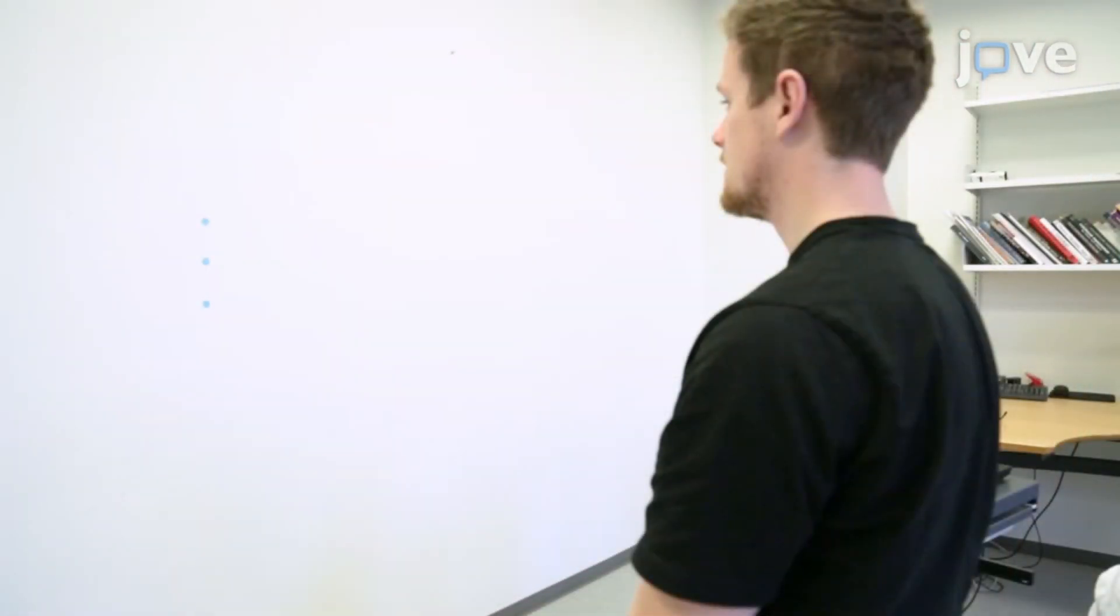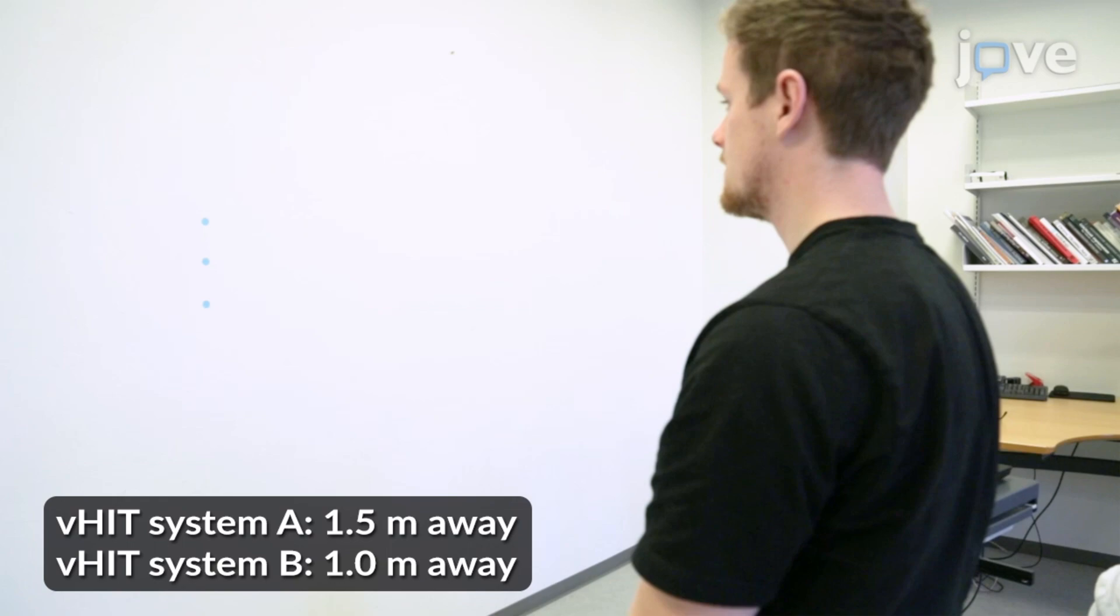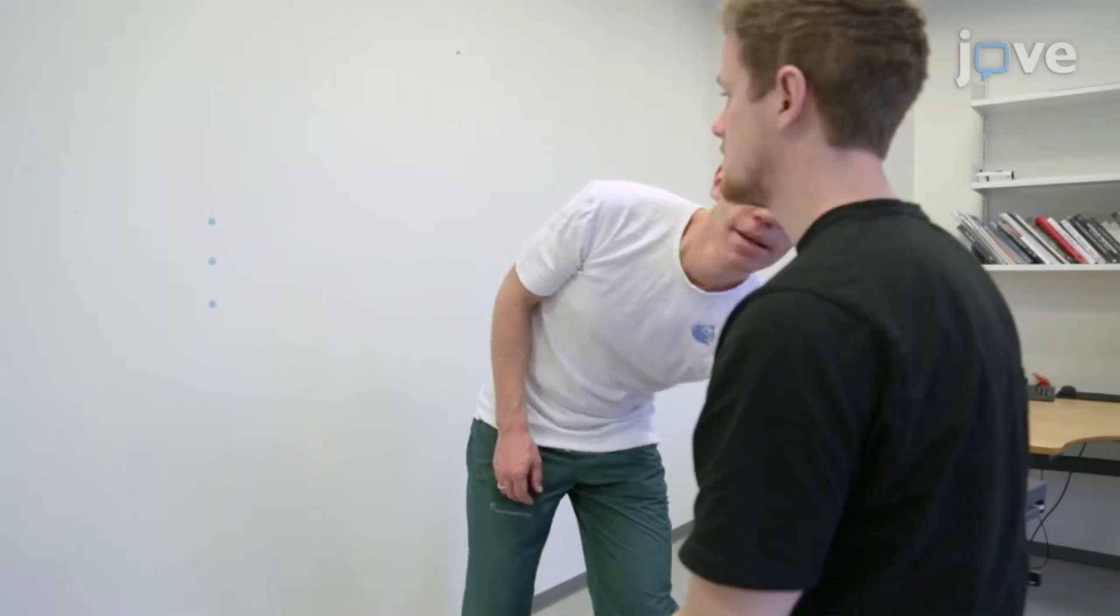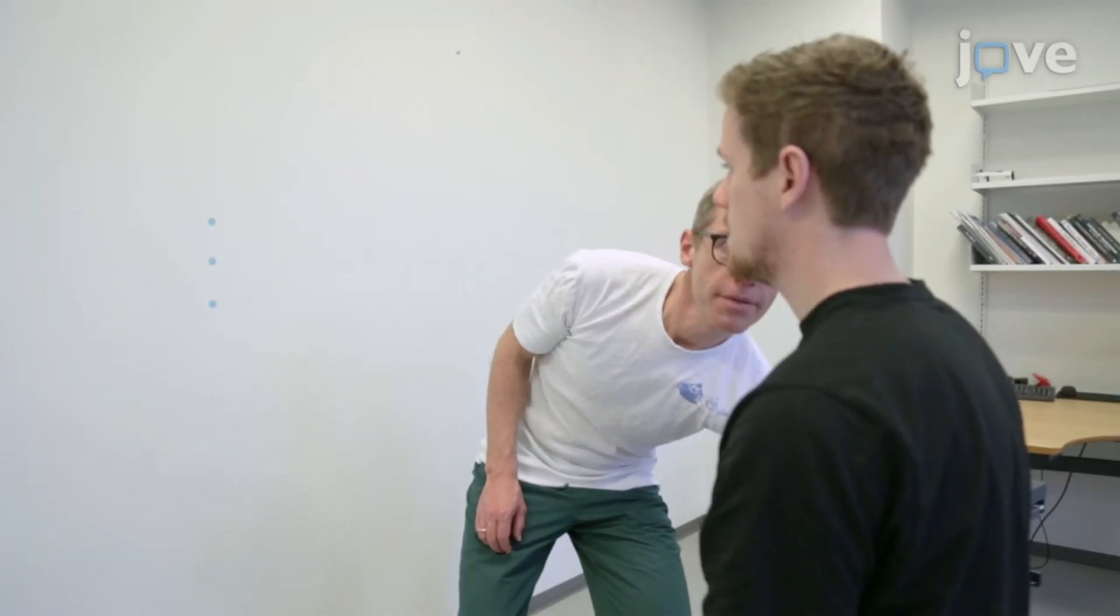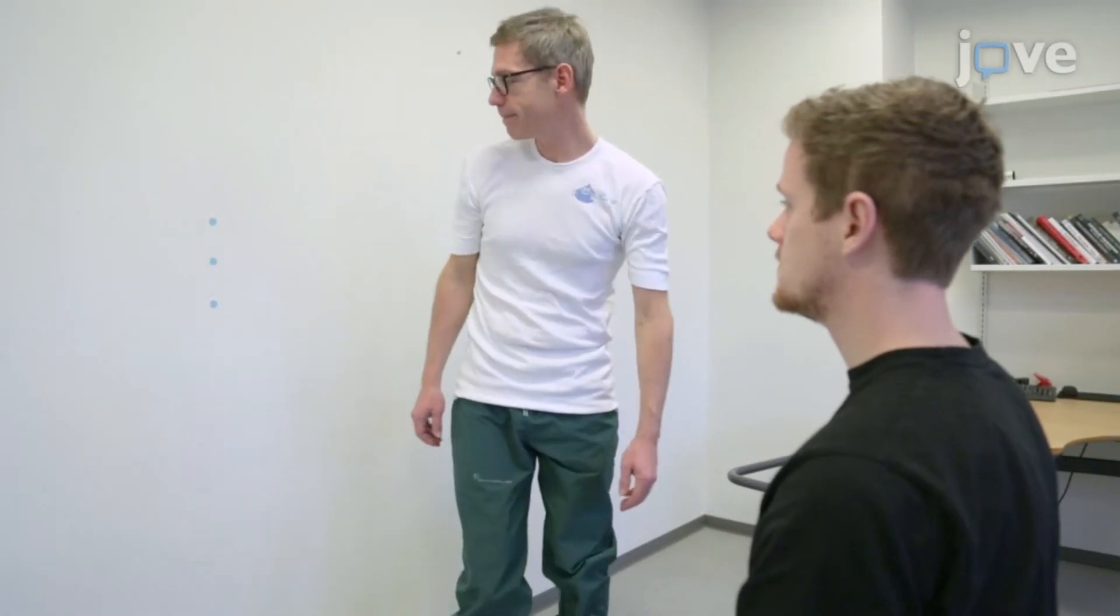Seat the participant in a non-rotating solid chair 1 to 1.5 meters away from a fixation dot placed on a wall for video head impulse testing or VHIT, depending on the type of VHIT system being used. As an alternative, place several dots in a vertical line at different heights. Adjust the height of the chair so that the eyes of the participant are leveled with the fixation dot.